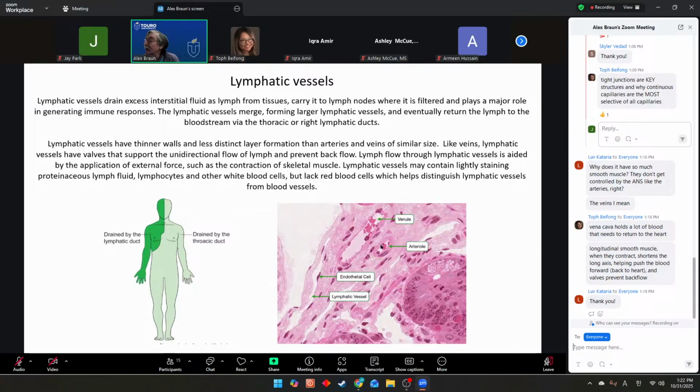Notice the arteriole has a smaller diameter, a smaller lumen, and a thicker wall. Notice the venule has a larger diameter, a larger lumen because it stores more blood, and a thinner wall compared to the arteriole. But that's a side issue in this particular picture.